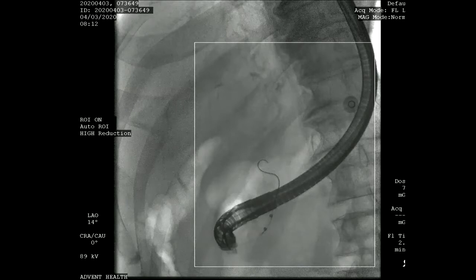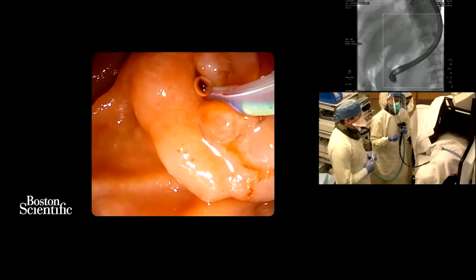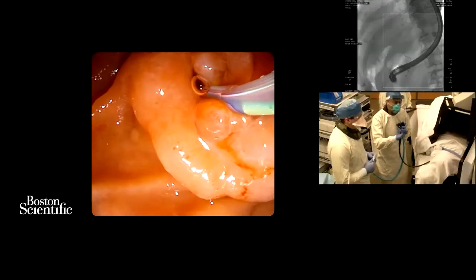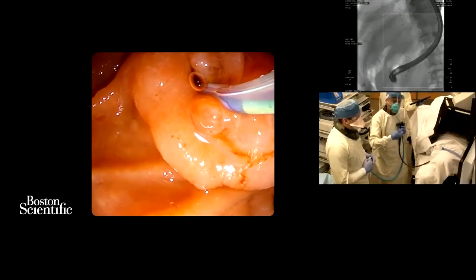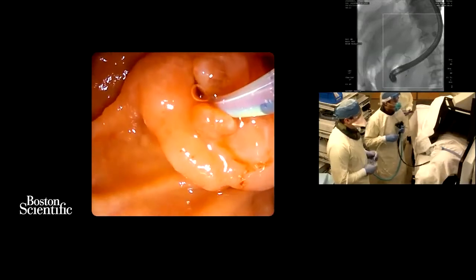And I think it is not uncommon to learn that we as endoscopists occasionally do have lung cancer, even without a history of smoking, and so forth, which we ascribe to occupational radiation exposure. So having this technology integrated, what we found is that there are significant advantages to the patients and to providers in the room because it decreases secondary exposure to people in the room.